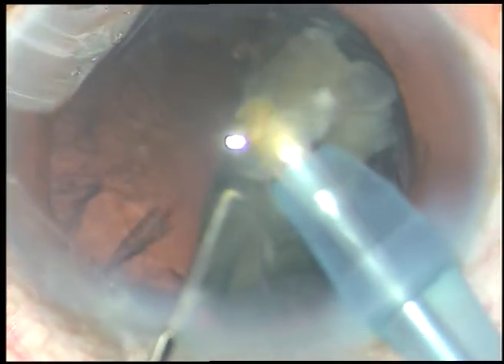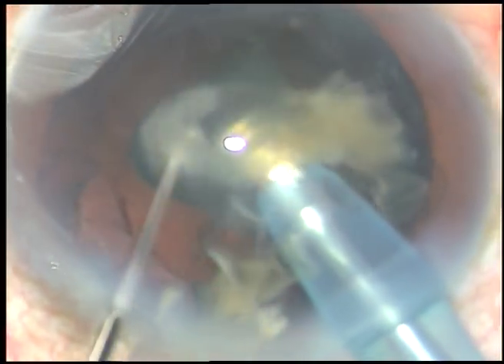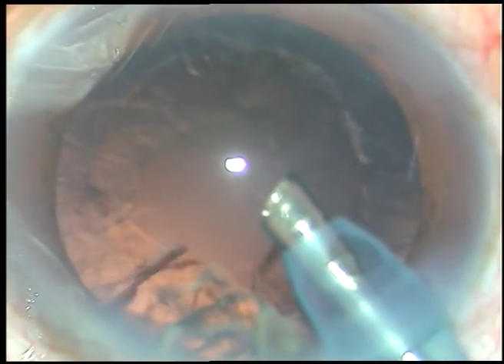This is the last portion of the nucleus. See what is done after emulsifying up to this point — when the last bit of nucleus is remaining, I remove the chopper and do the emulsification single-handedly. What happens is the leakage of BSS through the side port stops or becomes minimal and the anterior chamber becomes very stable.